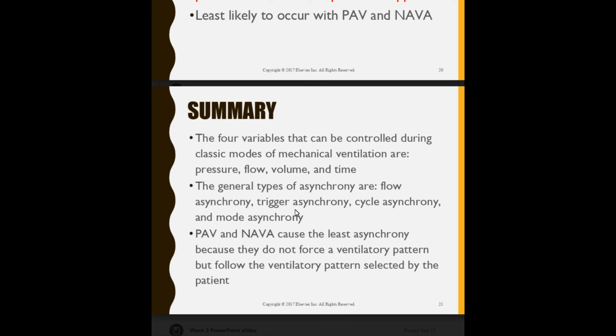And so by taking care and maintaining the ventilators, as well as making sure that the patients have good flow, that they have good sensitivity. For cycle asynchrony, you want to make sure that the I time is mimicking the patient's I time. And also mode is definitely going to be based on your assessment skills. So you want to make sure that the mode that they're in is correct.